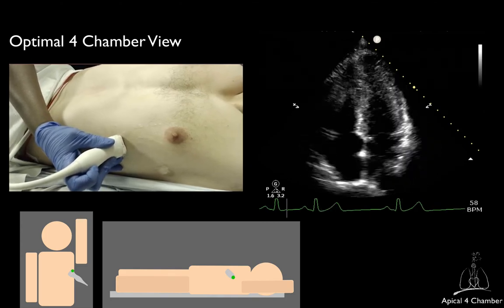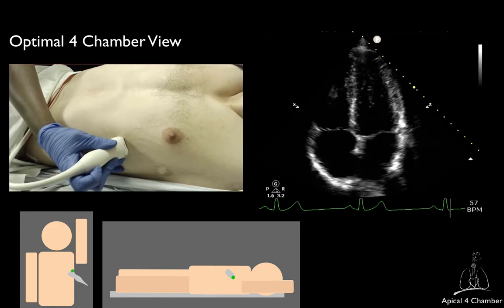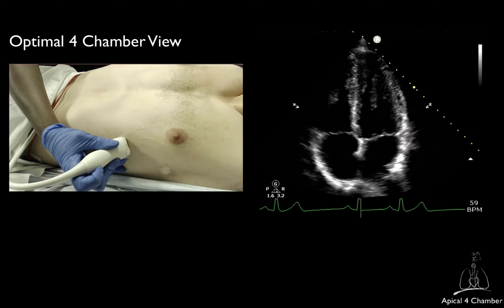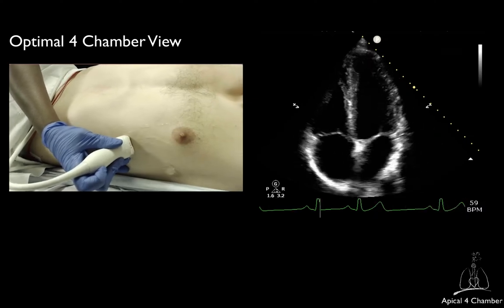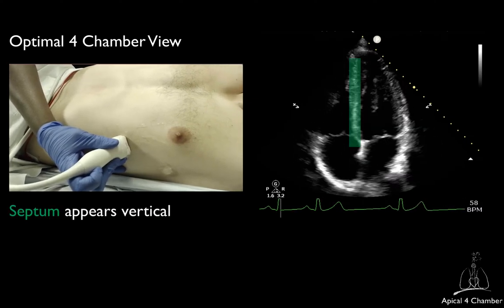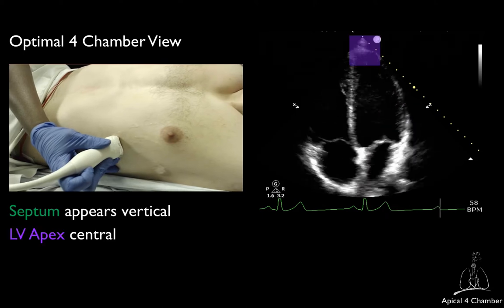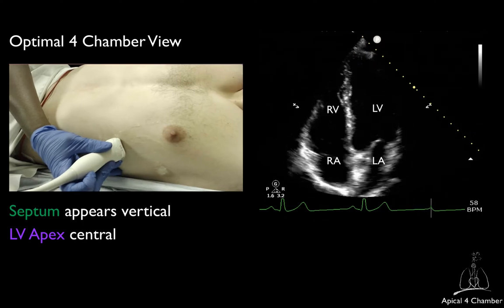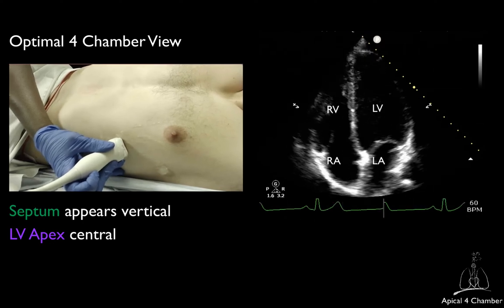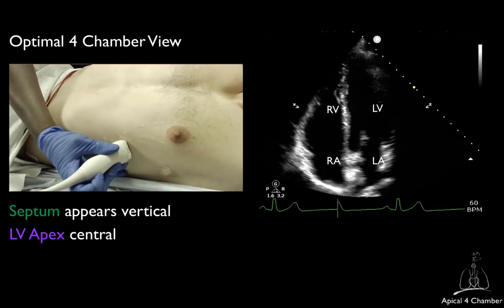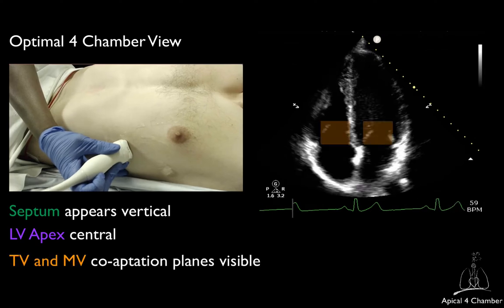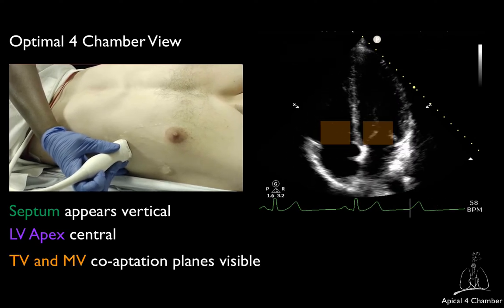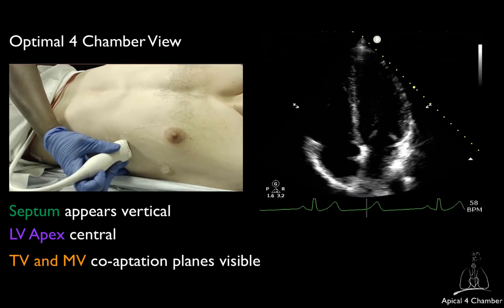You should direct the ultrasound beam in the direction of the sternal notch. In the ideal apical 4-chamber view, the septum appears perfectly vertical, the left ventricular apex is positioned in the center of the scanning sector, all 4 chambers — right and left atria, right and left ventricle — are visible, and the coaptation planes of the tricuspid and mitral valves are both visible. The left ventricle is not foreshortened.